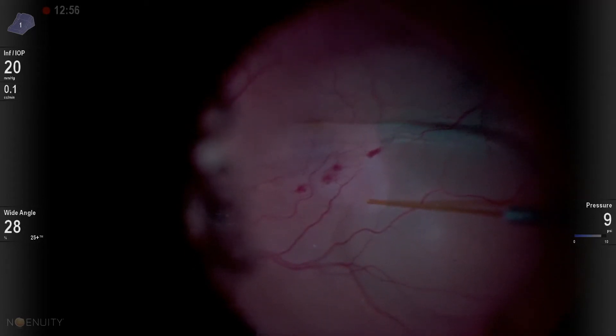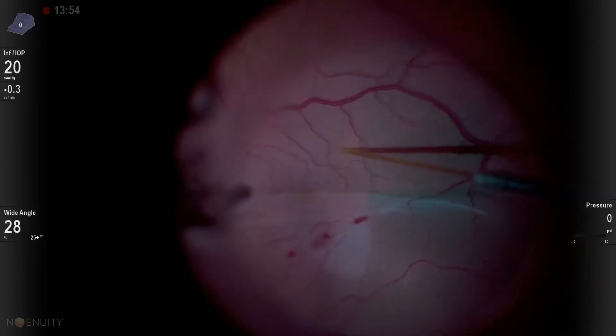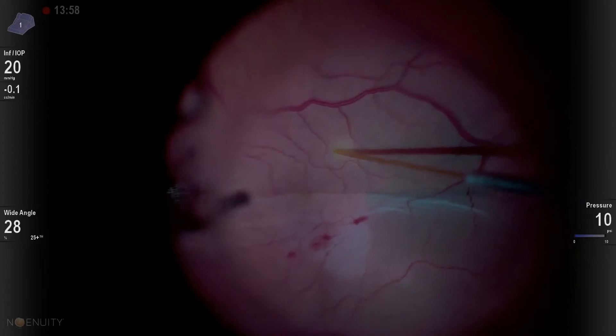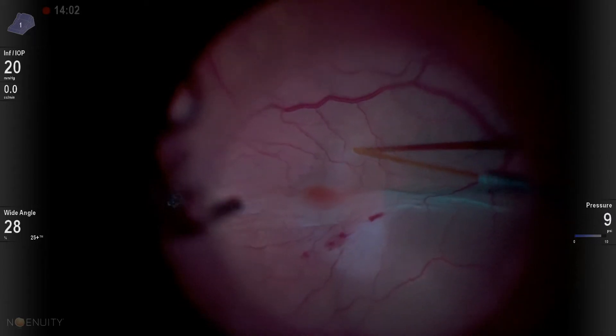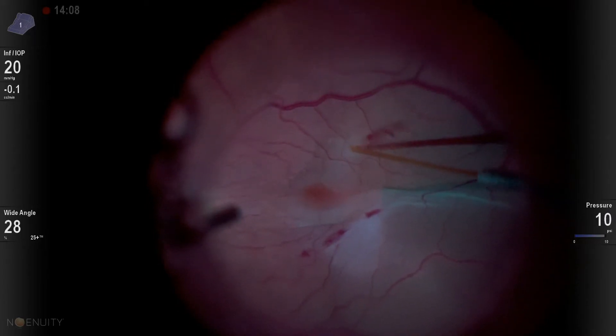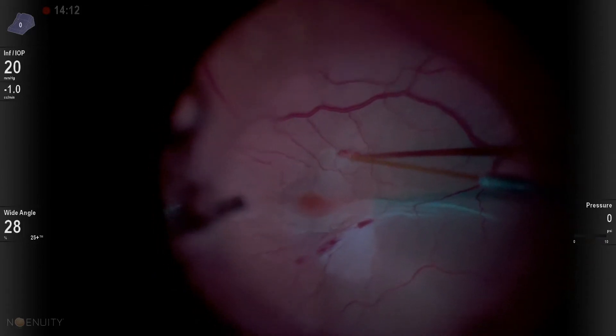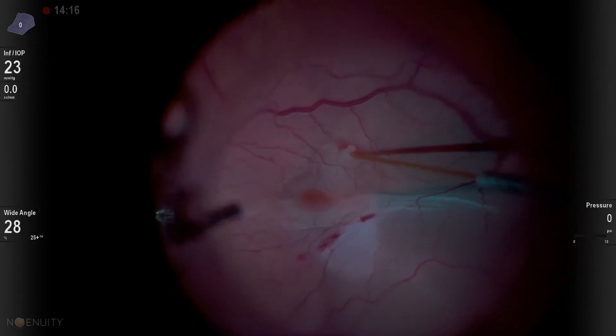And so my initial thought is, okay, these 39-gauge incisions that we're making to inject are small, so let's just try to go in a different location. So I start to inject in a different location, a little bit of hemorrhage there, so I increase our pressure.